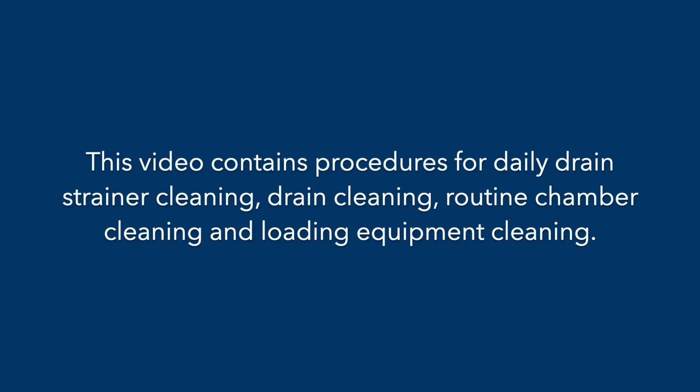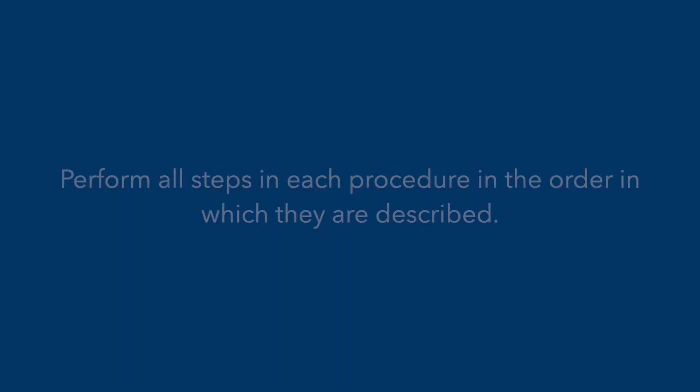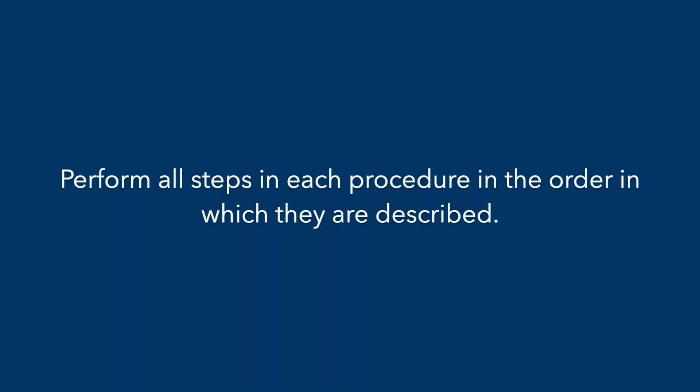General Guidelines: Watch this entire video before cleaning. This video contains procedures for daily drain strainer cleaning, drain cleaning, routine chamber cleaning, and loading equipment cleaning. Perform all steps in each procedure in the order in which they are described.